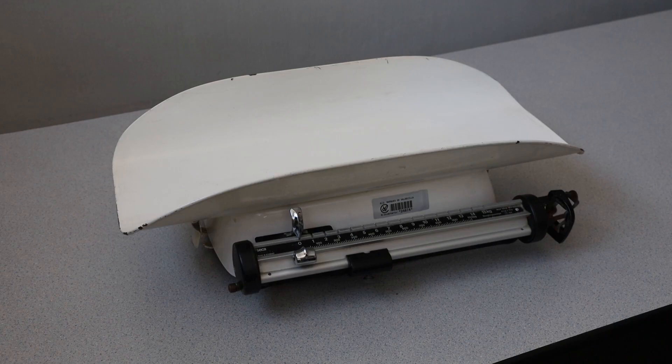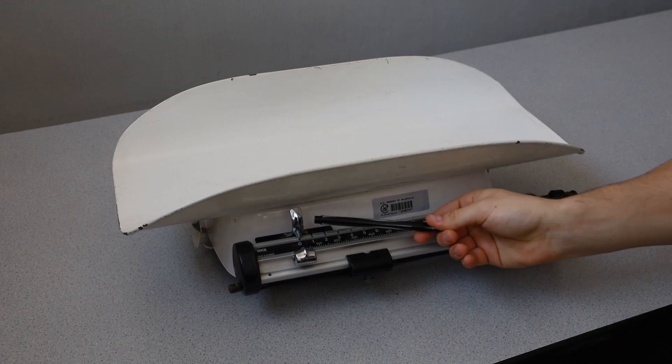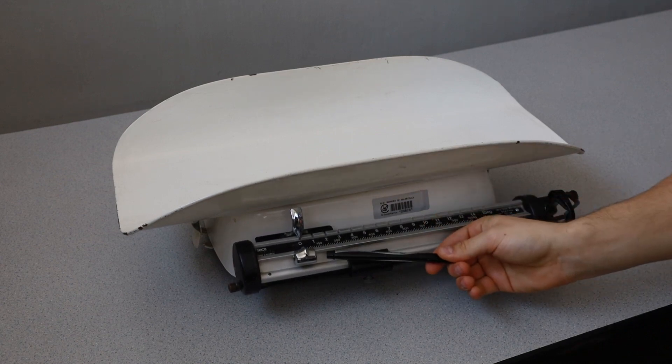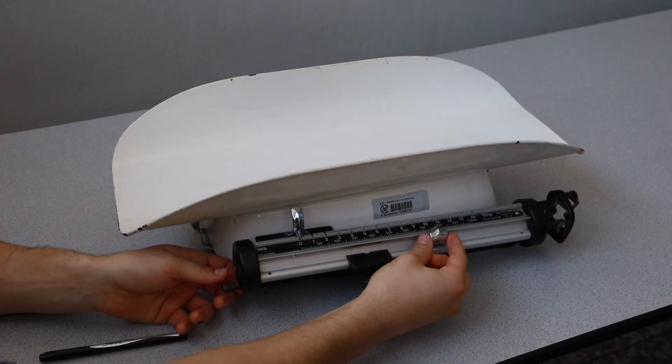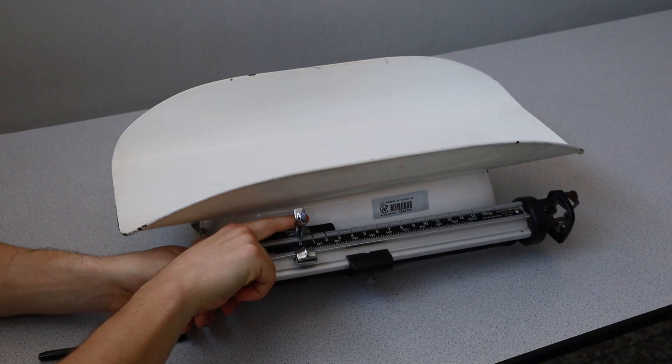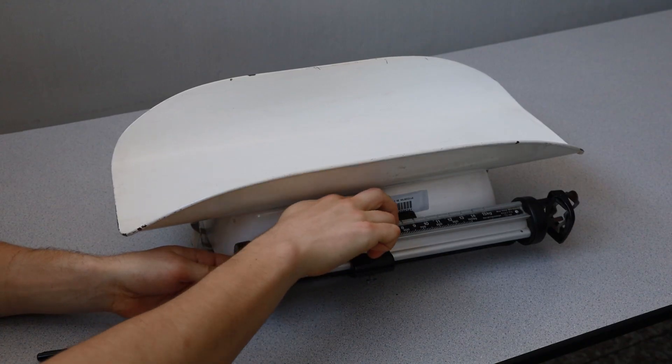Most infant scales will have two known weights that are used for performing a weighing: the large sliding weight and the small sliding weight. Both of these weights are able to slide along a metal beam in order to adjust the level of the beam balance.